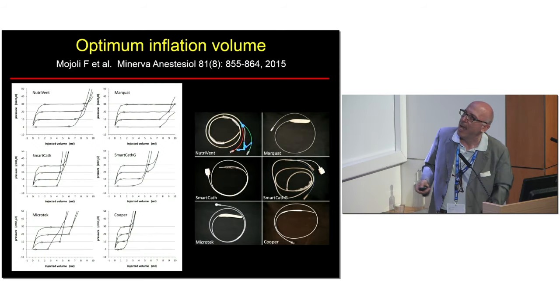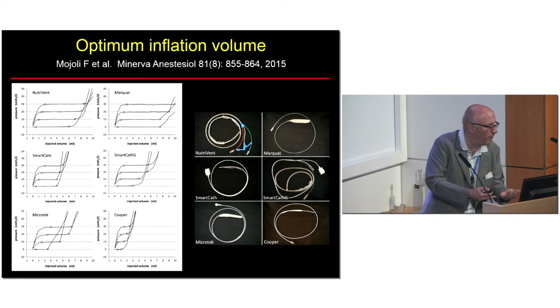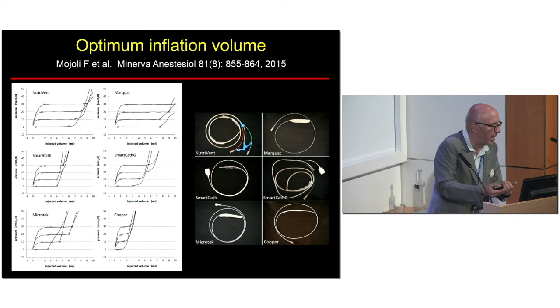So now, a very nice study from Francesco Mojoli in Italy. Here you have different catheters, always with a balloon. And here you see the compliance of the catheter, and this is performed at different levels of pressure, so lower level of PEEP or higher level of PEEP, okay?